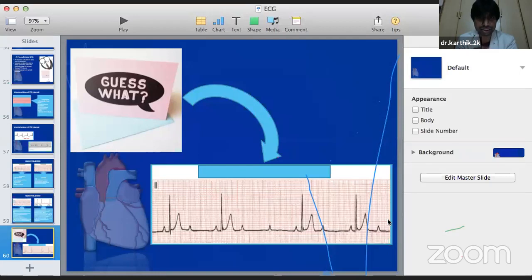That is why in lead V1 you see a positive wave followed by a negative wave, because the right atrium is located more anterior in the chest than the left atrium. So the right atrium gives a positive deflection in V1, which sits right along the right atrium, with the impulses traveling towards the lead. So they produce a positive deflection in V1, which is much larger.